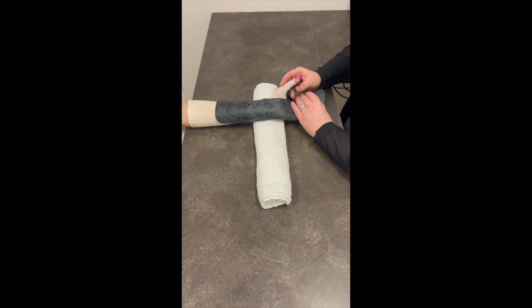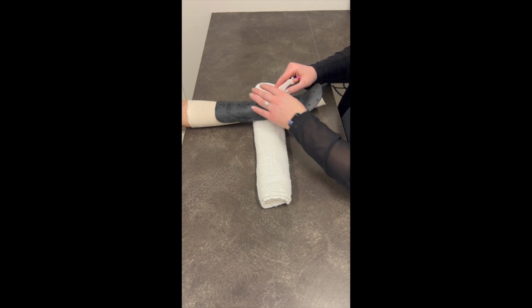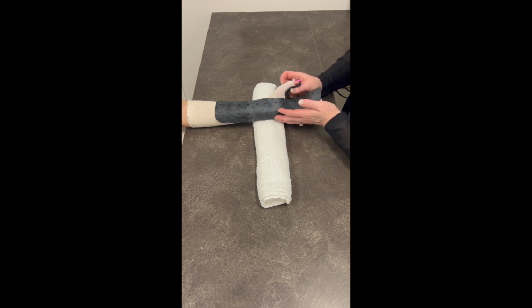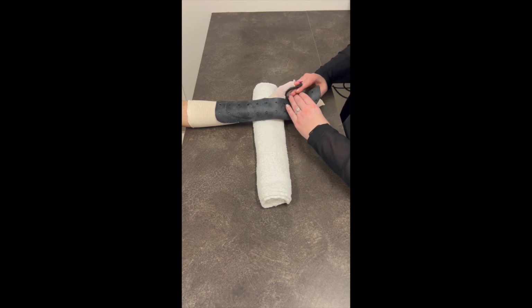So we want slight flexion of the MP, PIP, and DIP joints, and slight flexion of the thumb as well. And the thumb, we're going to position in kind of more palmar abduction because that is the more functional position of the hand. But you can change up the position of that as needed.